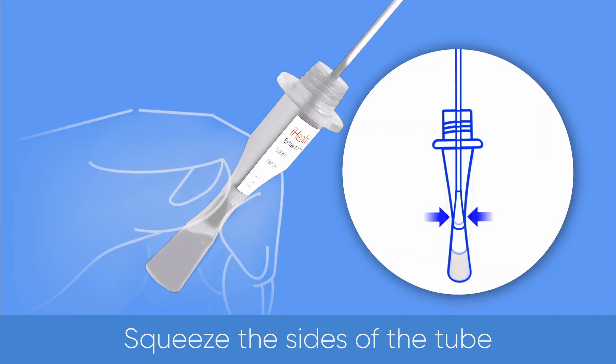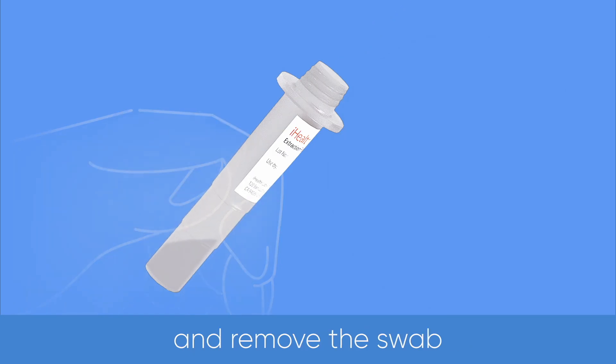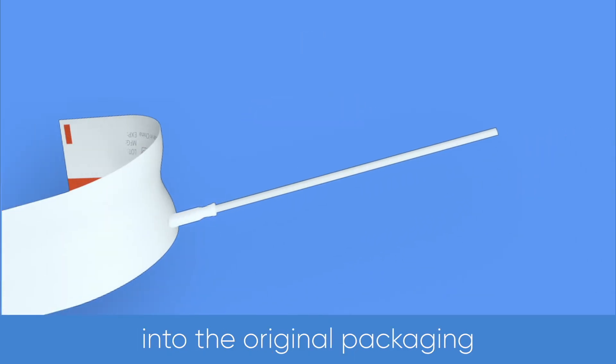Squeeze the sides of the tube to express as much liquid as possible from the swab, then remove the swab. Screw back the orange cap. Place the used swab back into the original packaging.